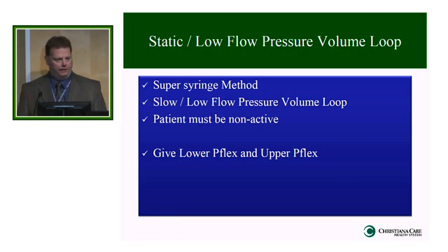And then different ventilator companies, the ones back here, have that on it. I'm guessing they have that option on here. I don't know if you've played with it, and then there are other brands that have it, and they have their proprietary names on it, but they have a way of doing a slow flow pressure volume loop to determine the lower and upper P flexes.